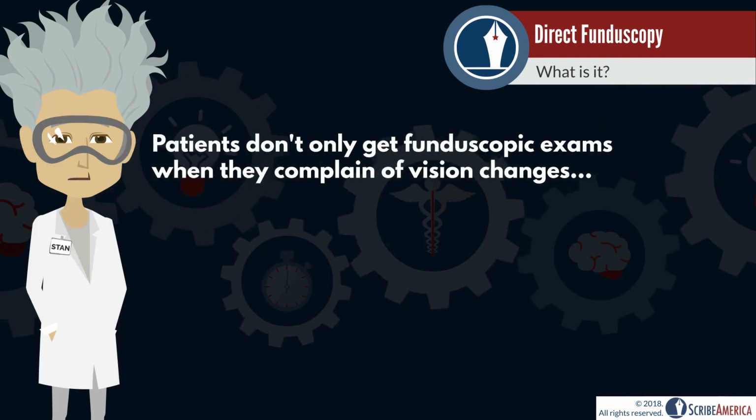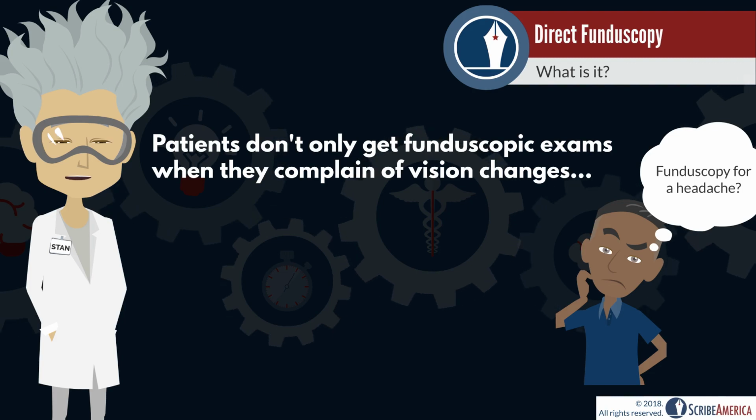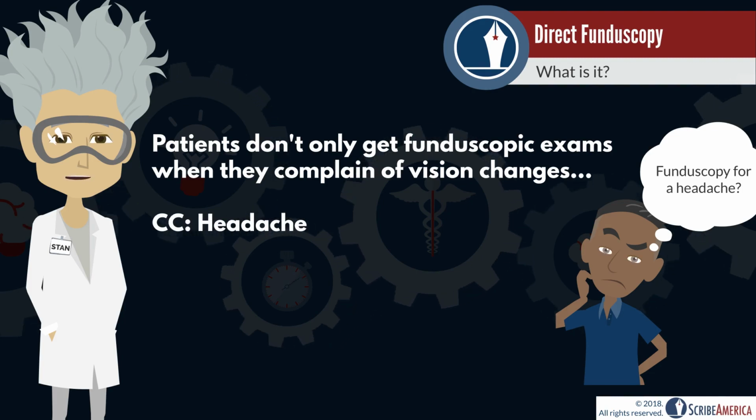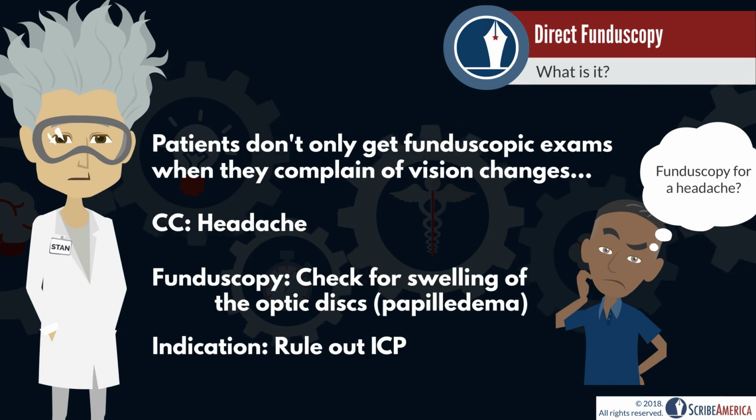Be aware that your clinician may perform a funduscopic exam in the absence of obvious vision or eye-related complaints. Let's use headache as an example. The clinician will want to ensure that the optic discs are not swollen. This is known as papilledema, and it's a sign of increased intracranial pressure.